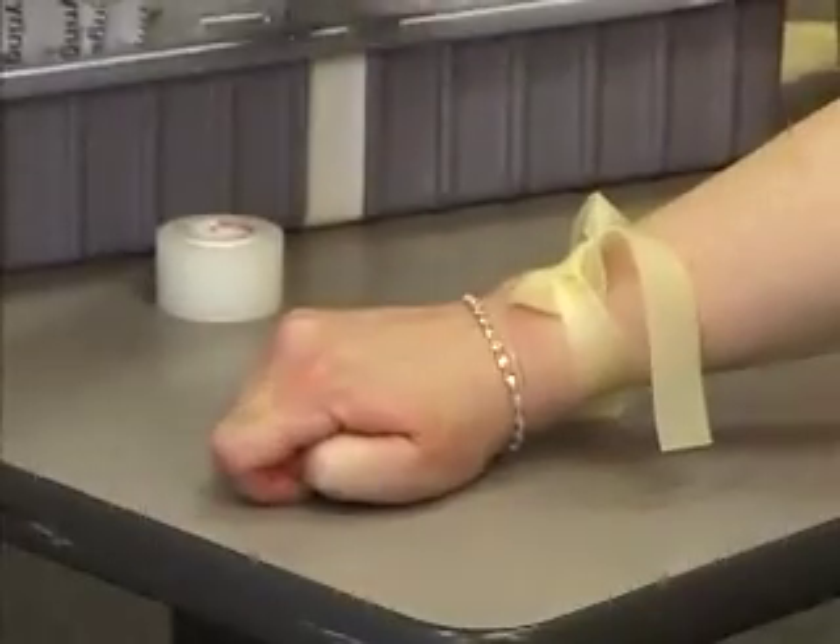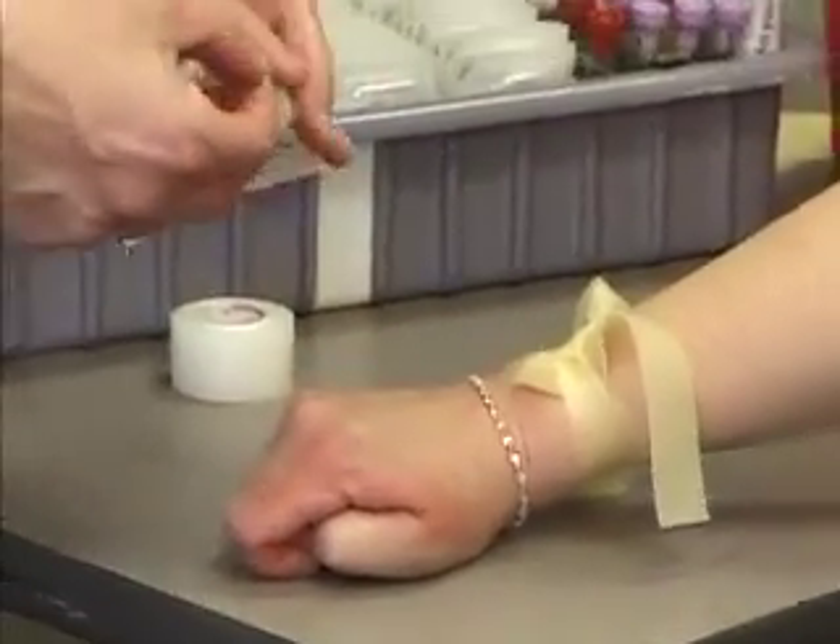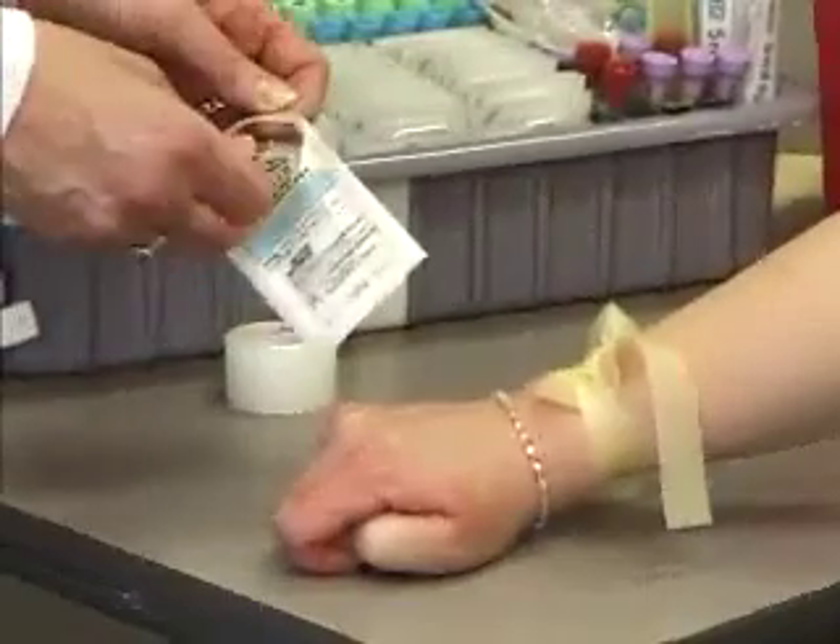For this procedure, we're going to use a butterfly. You would always want to use a butterfly on the back of the hand — never a vacutainer needle.